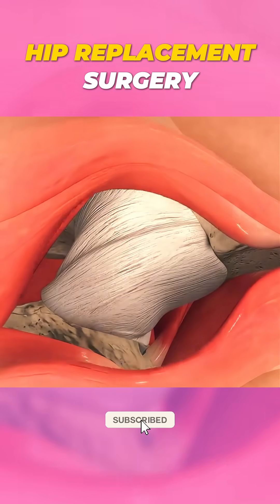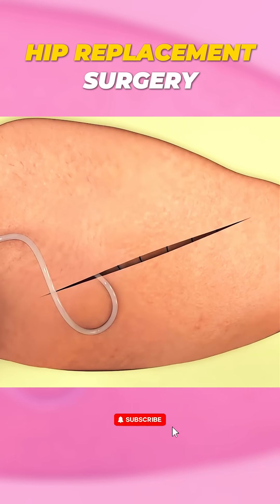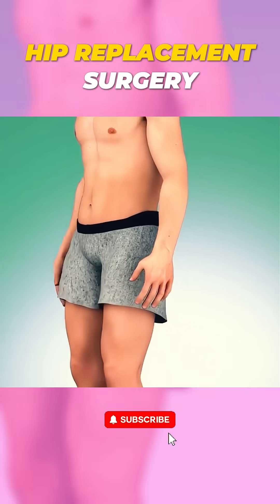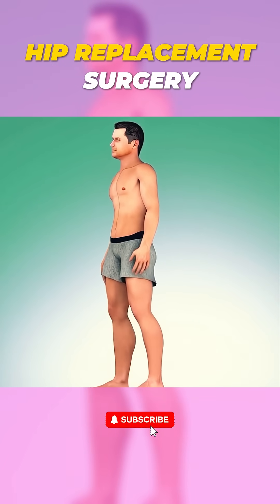The big difference here is the approach. By going through the front, it reduces muscle damage, meaning a quicker recovery and less pain after the surgery. Patients can often walk the very same day with fewer restrictions compared to other types of hip replacement.